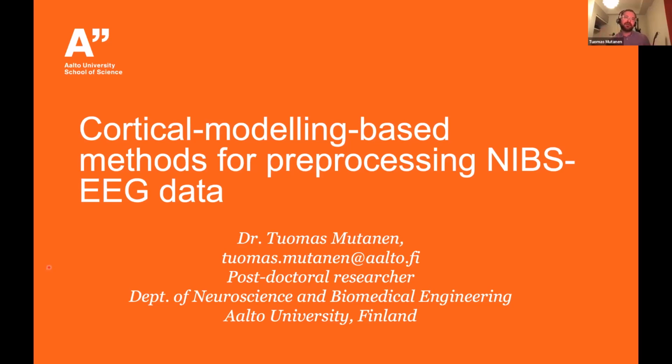Because of my background in mainly TMS and TMS-EEG, the examples that I will show will come from the TMS-EEG world, but I think that the principles and ideas could be also used for TDCS, TACS, EEG data, if you think about the strategies, how to apply them.